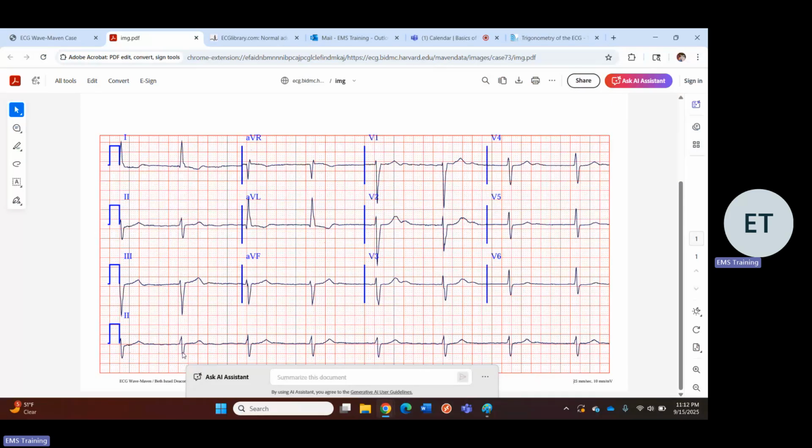It's like 6.5 boxes. 1, 2, 3, 4, 5, 6. It's close. It might be kind of regular actually. 1, 2, 3, 4, 5, 6. 6.5 boxes. 1, 2, 3, 4, 5, 6. 6.5. Okay, so this is actually pretty regular. Huh. Well then.